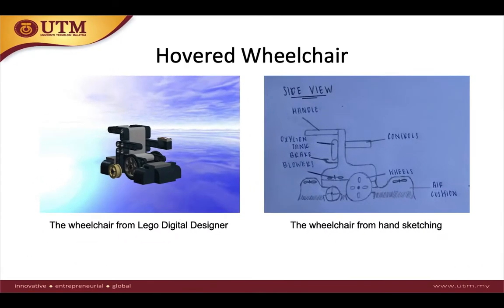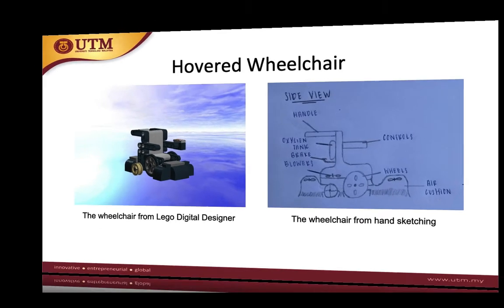In this slide you can see two pictures of my innovation of the hovered wheelchair. The left side shows the wheelchair from the Lego Digital Designer that I made, and the right side is my hand sketch of the wheelchair. More details of the hand sketch will be explained in the next slide.